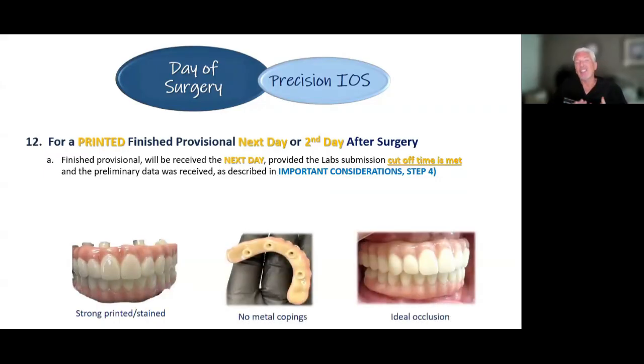So now you've got the information to the lab, and let's assume that you did get all the preliminary scans in and you've sent your scans to the laboratory.